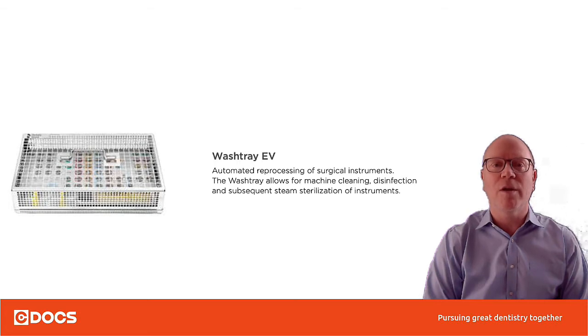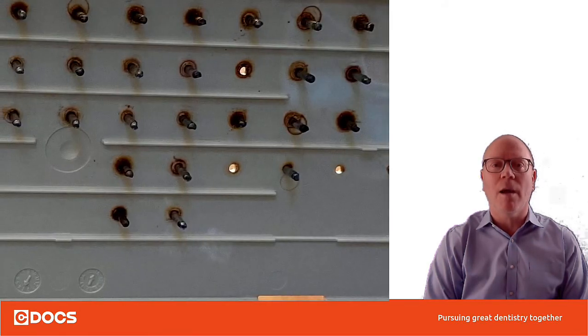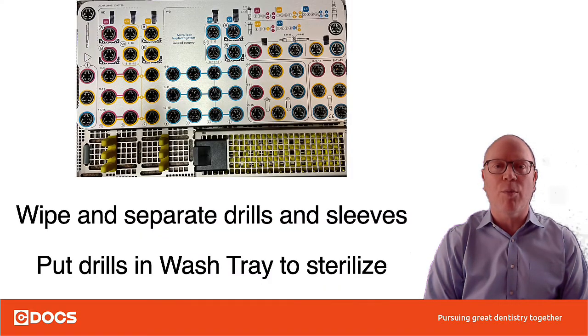When you go to sterilize, you want to use the wash tray EV, which you can order through your implant rep. I used to sterilize everything in the plastic tray, but I don't do that anymore because you get a lot of stuff built up. If you take the plastic tray apart and look at the drills from underneath, look at all the gunk that builds up — think about how that might be contaminating your surgery.